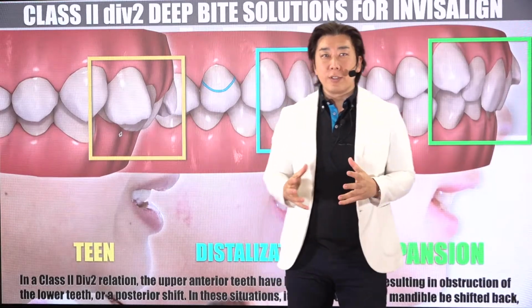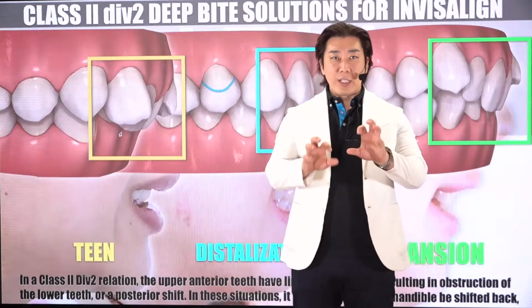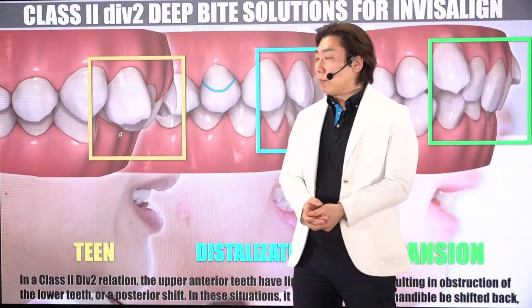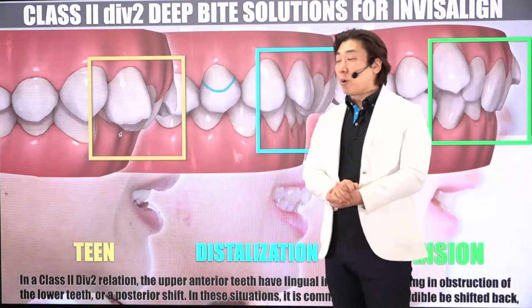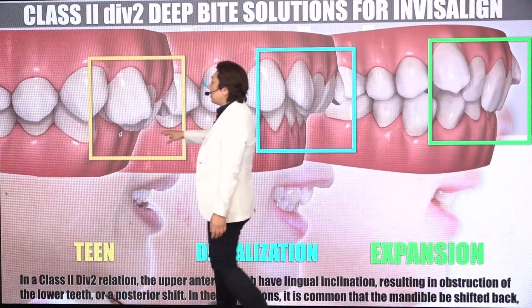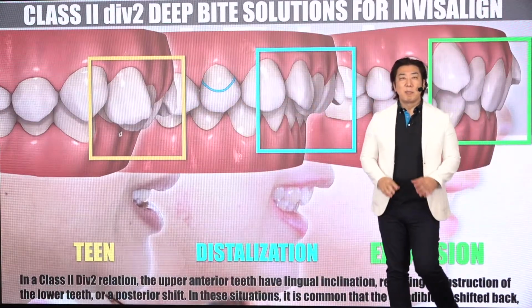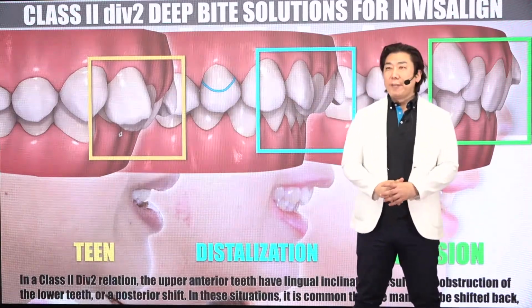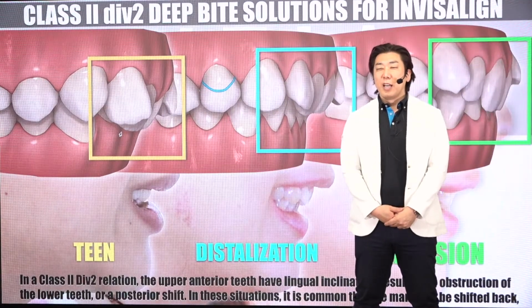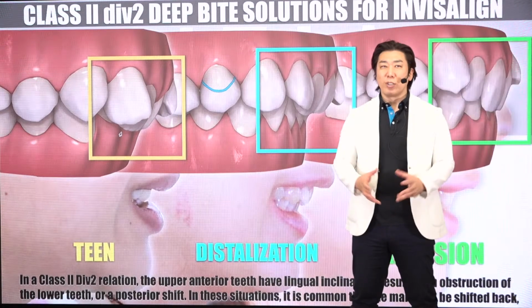Take the scanning procedures of the patient's teeth, then send them to Align Technology, then create the ClinCheck program. Is this okay or not? You already understood this is not good, because with all these patients we have to think about the joint, anterior guidance, the position of the mandible. Without thinking about condyle position, only focusing on ClinCheck, maybe this treatment planning is not good.